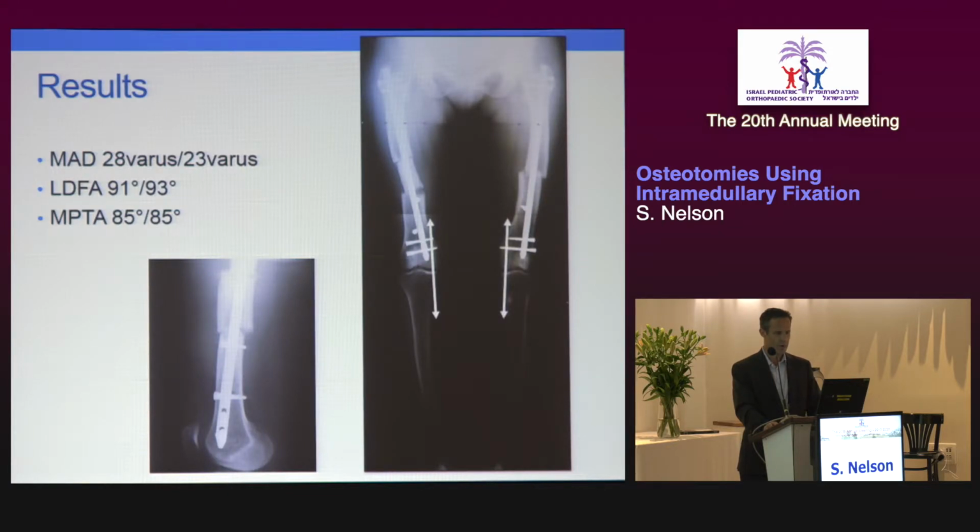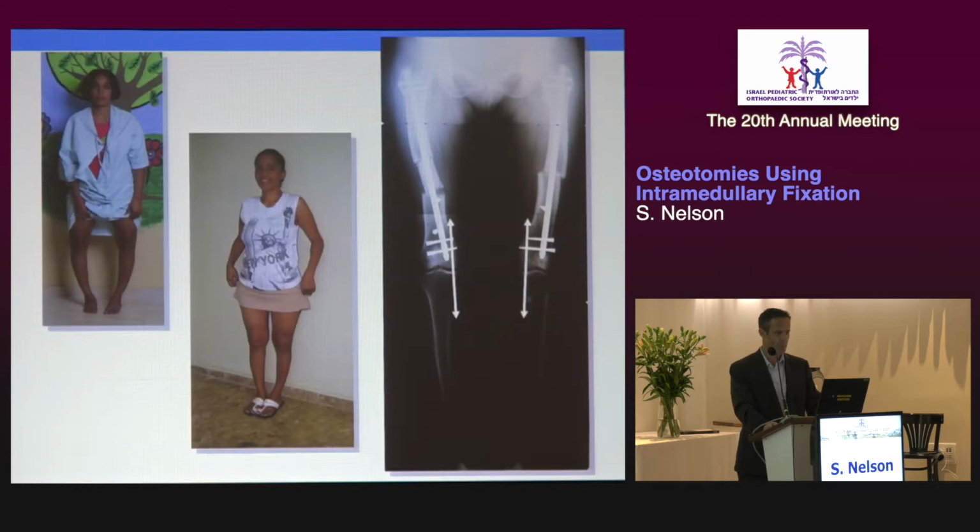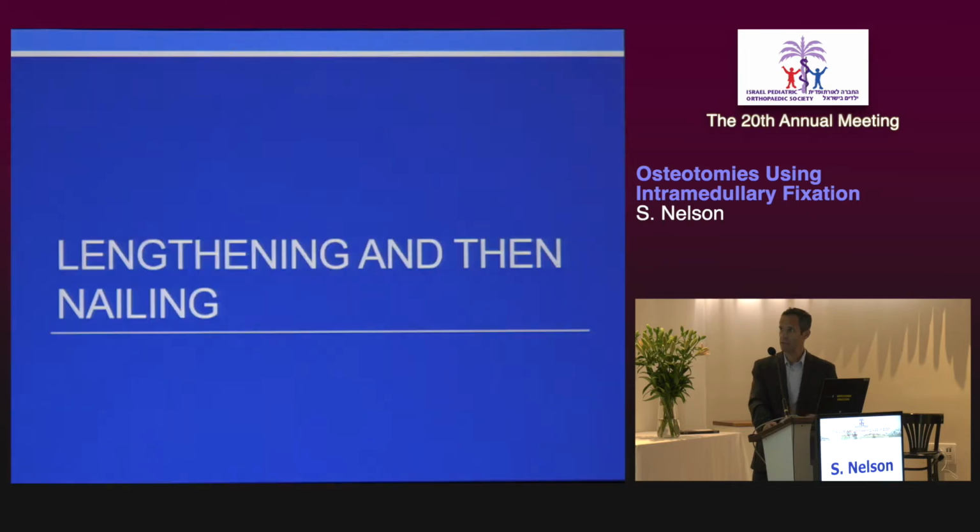Placing a temporary external fixator and then an antegrade nailing technique was performed in this case. This was one of my earlier cases, and it's actually easier and more accurate to do retrograde nailings. Oftentimes we can't do it in the pediatric population because of an open distal femoral growth plate. And pre and post-operative image, she's still in a little bit of varus there, major improvement from before. And again, note the blocking screws placed on the concave side of the original deformity here.